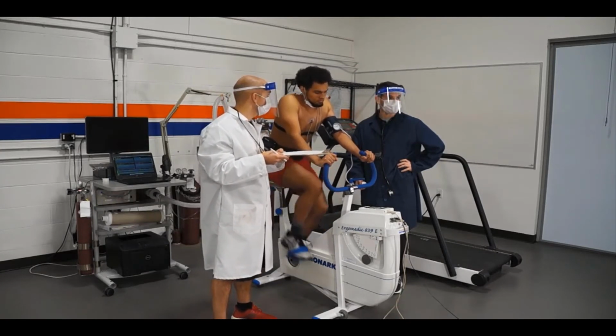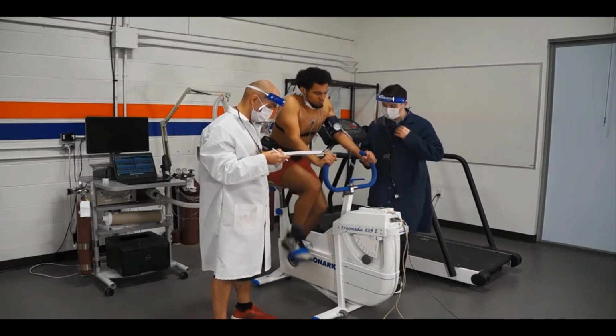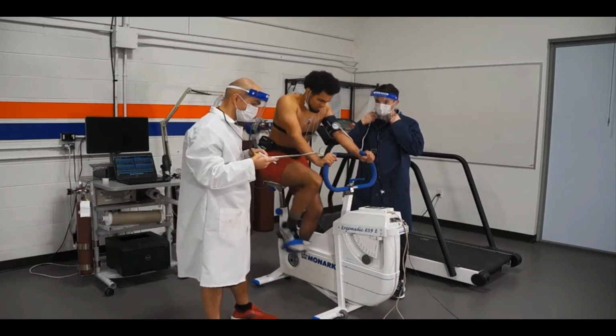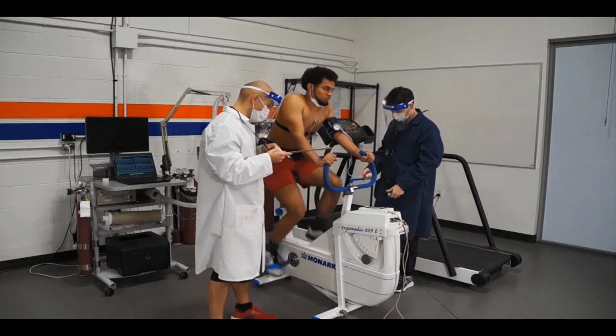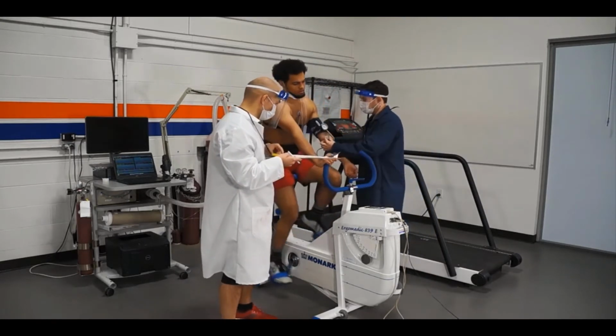And I just sat there for a minute 50 before it. But really there's nothing you can do in that minute 50 other than talk to your participant, make sure they're doing all right, talk to your co-experimenter, and really make sure that, okay, yep, coming up, one of us is watching, okay, 20 seconds out, okay, getting ready for your measurements. Okay, there, you see our nod, good communication.